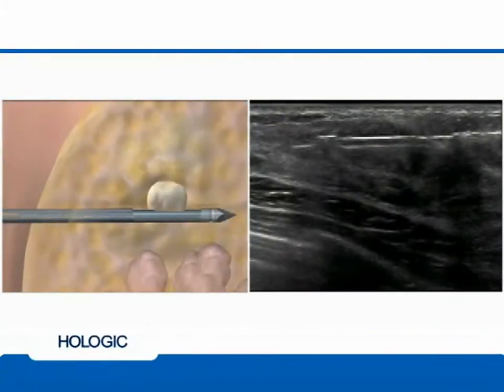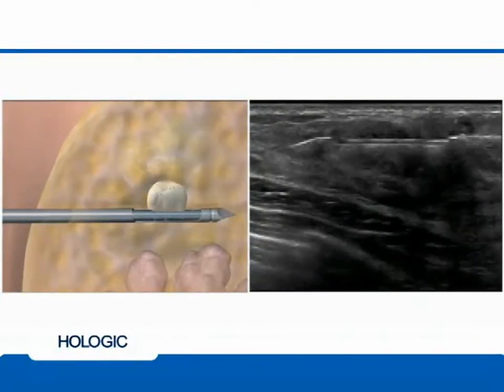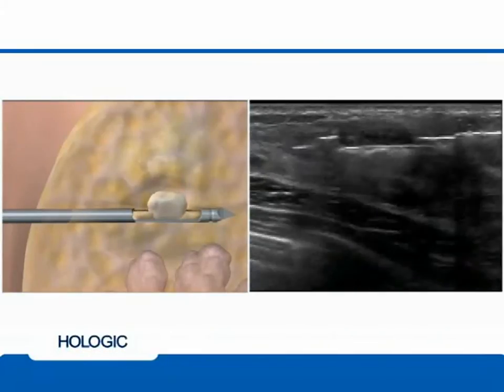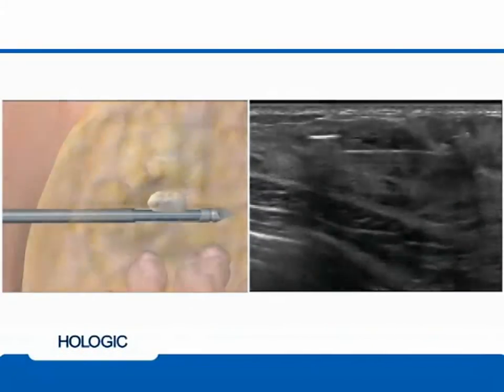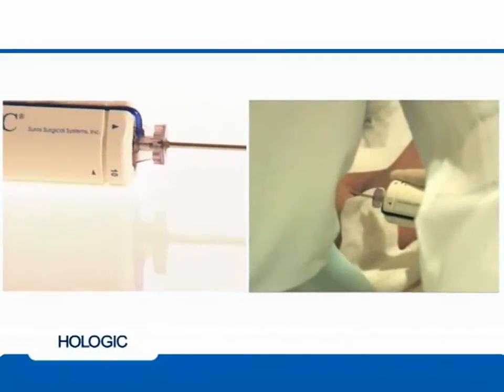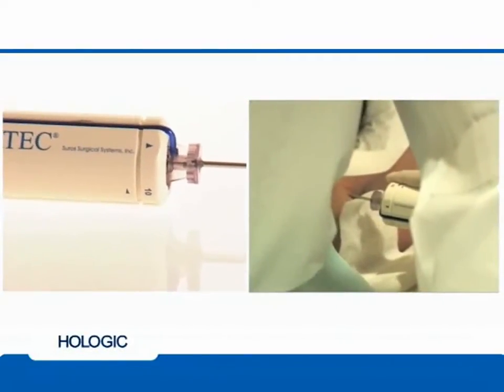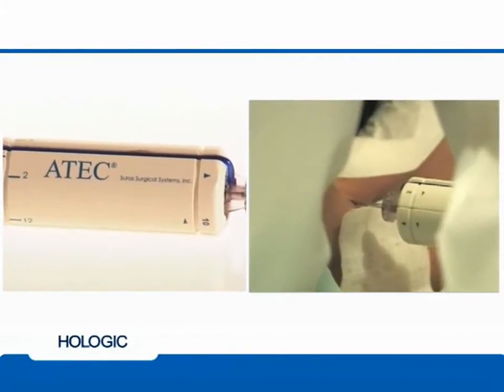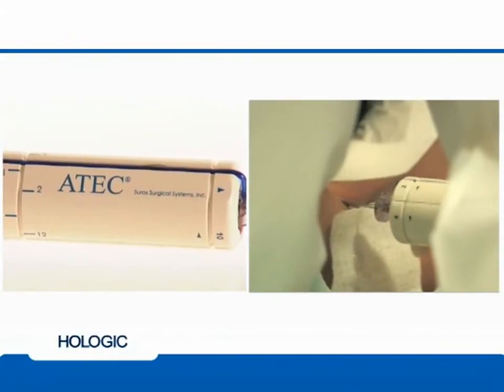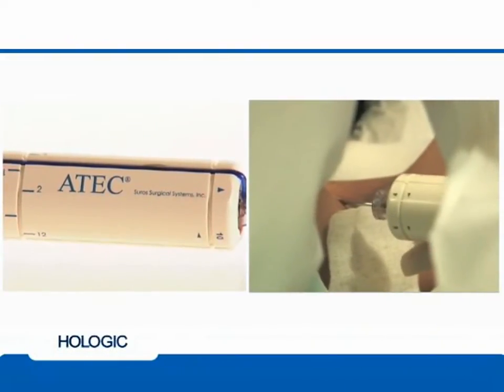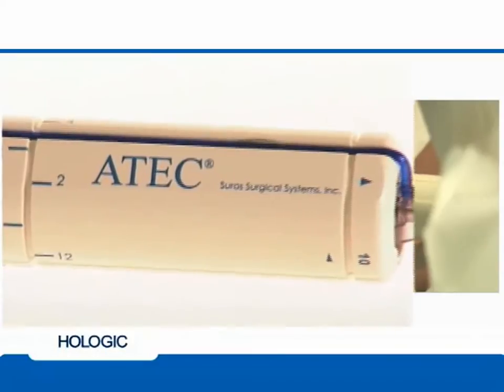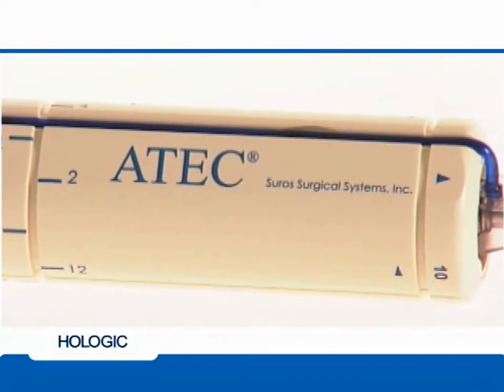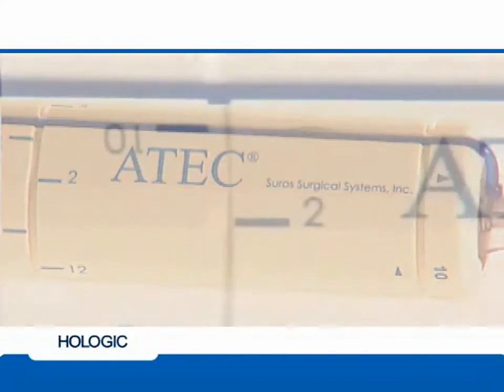Most clinicians target below the lesion, turning the cutting aperture to the 12 o'clock position. The position of the lesion should be located in the center of the cutting aperture. This position allows for optimal visibility of the needle cutting cycles and lesion removal. The flat surface of the handpiece indicates the 12 o'clock position and serves as a tactile indicator for the location of the cutting aperture.